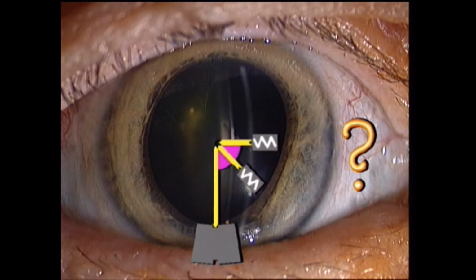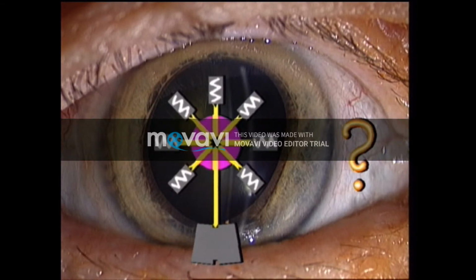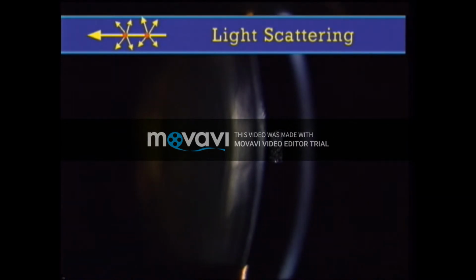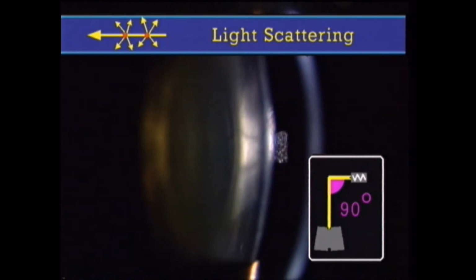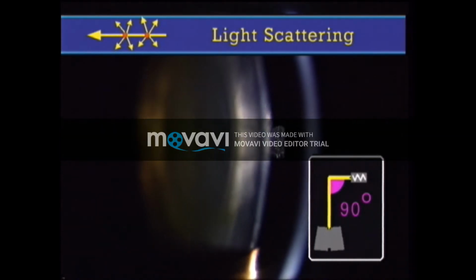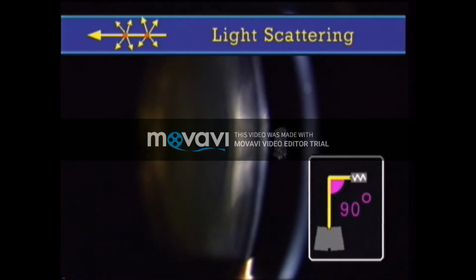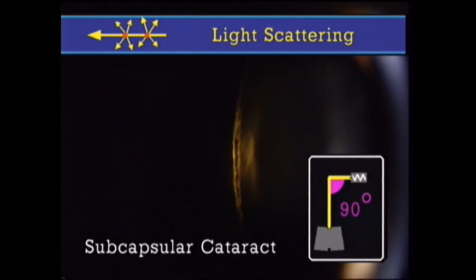What illumination angle should be chosen for slit lamp microscopy? The choice of the angle in a given situation depends on the goal of light application. These angles shall be explained by a case of chronic anterior segment inflammation. If the goal is the generation of light scattering, the illumination angle should be as close to 90 degrees as conditions permit. This is shown by the cross-section through a lens, which, although transparent, becomes distinctly visible. Here it is in sharp focus at the anterior cortex. Here at the center at the lens nucleus, and here at the posterior cortex where a subcapsular cataract exists.